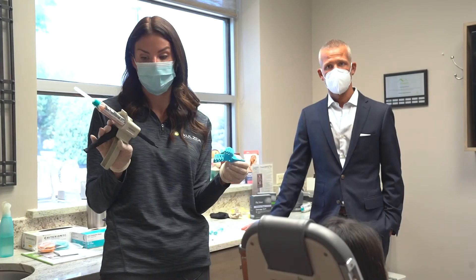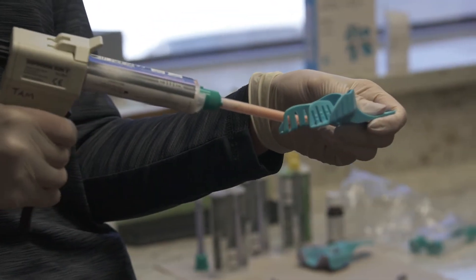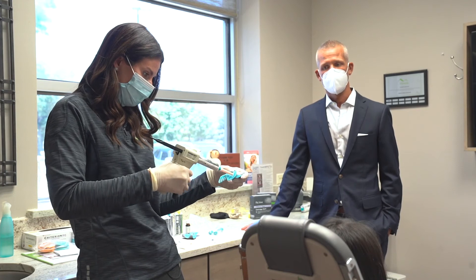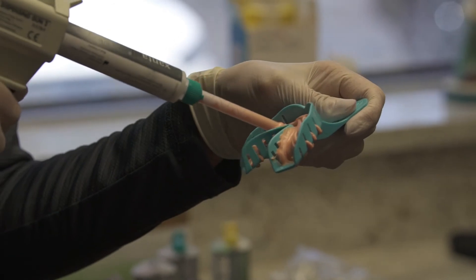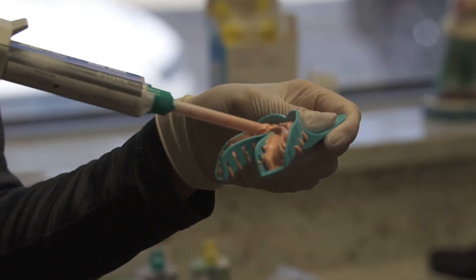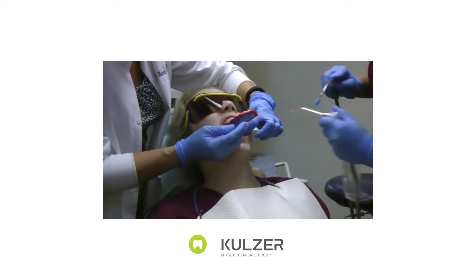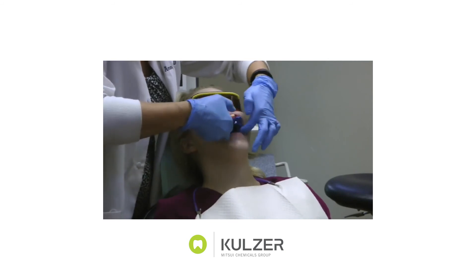We're going to take the Xanasil material and place it inside the tray. This material has a one-minute working time and a one-minute-30-second set time, so it's pretty fast. It's also great for taking preliminary impressions for temporaries. Once the material is loaded, seat the tray inside the patient's mouth and let it sit for a minute and 30 seconds.